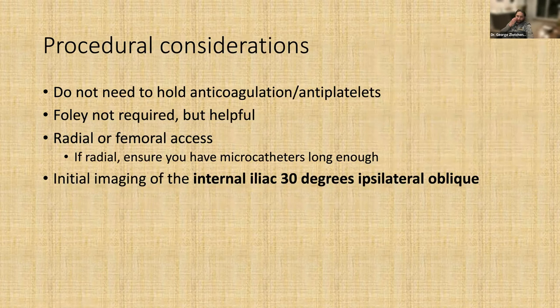So some things to consider during the procedure. You do not need to hold their anticoagulation or antiplatelets. We're not even holding it with femoral access, but I do a lot of these radial, so you don't have to worry about that at all. They don't need a Foley, but I always use a Foley. It really helps you localize the prostate. I put a little contrast in there. Any added benefit really helps and decreases procedure time.